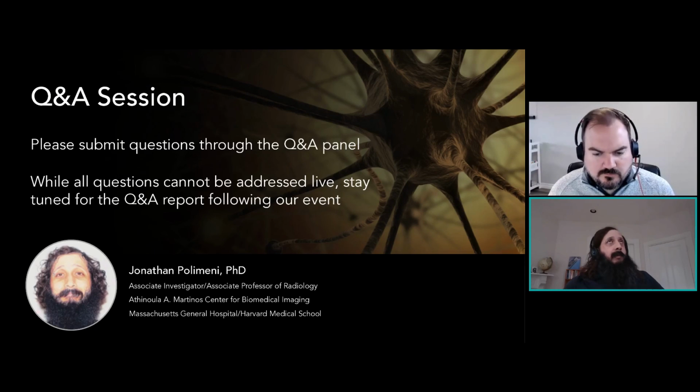And so, what's important, I wouldn't say that that precludes the use of fMRI. As I mentioned, fMRI is reimbursable for pre-surgical mapping in tumor patients. What we have to be mindful of is that if the relationship between the neural activity and the vasculature is different or impaired, this could influence our observations. It might result in false negatives.